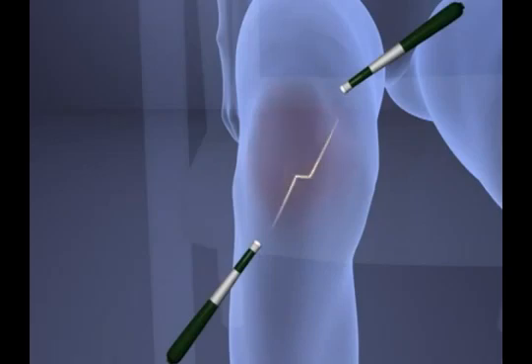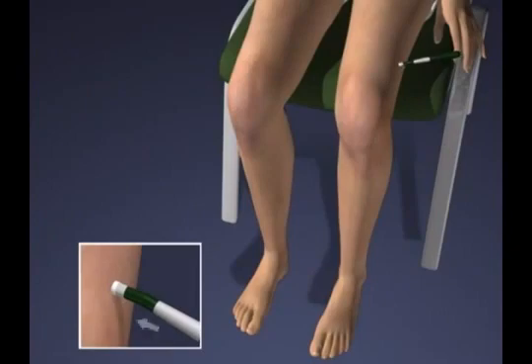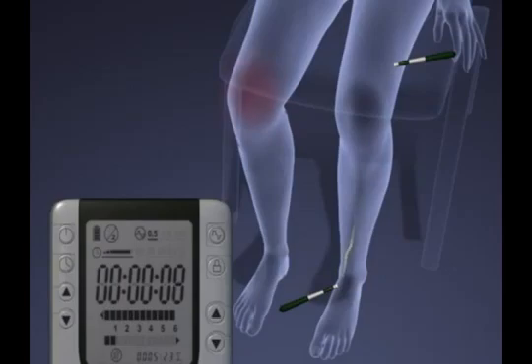Apply the two probes to at least 6 different angles, with the probes always placed on opposite sides, such as front to back or side to side. Treat the same body part on the opposite side of the body in at least 2 places. In this example, treat the other knee.